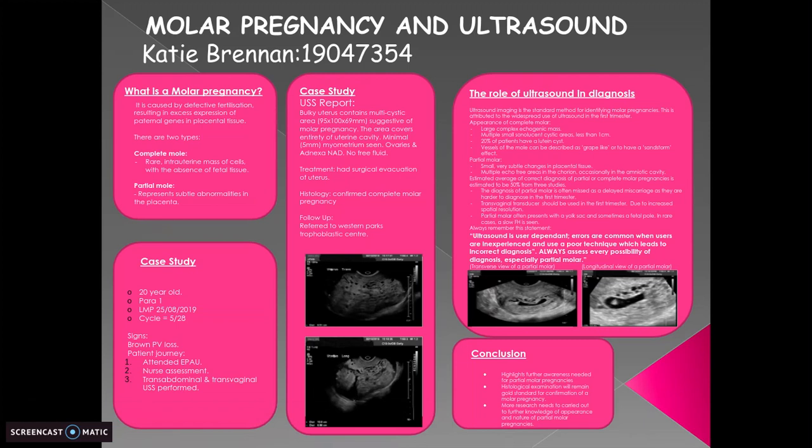I'm currently a staff nurse working in gynecology, studying a PGC in medical ultrasound. Today I'm going to talk about an abnormal case study exploring molar pregnancy and ultrasound.